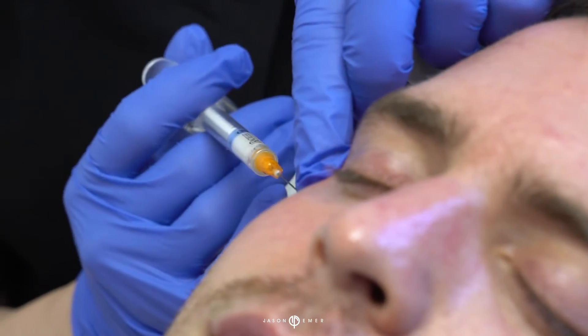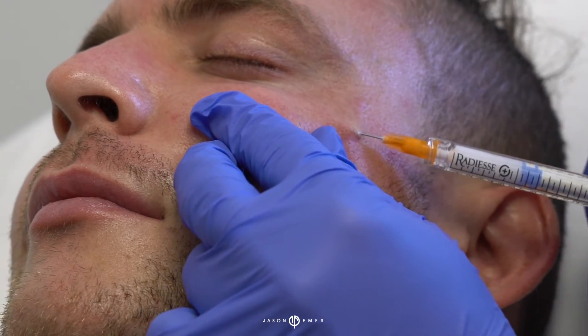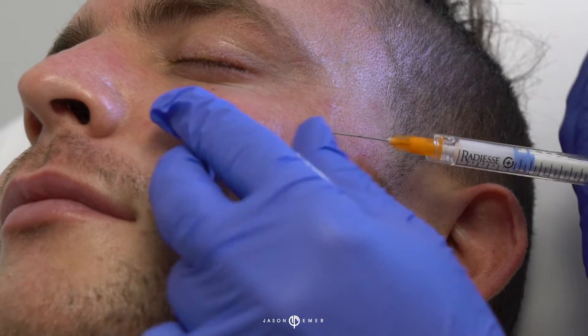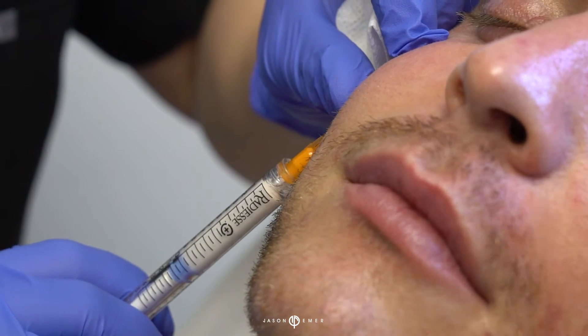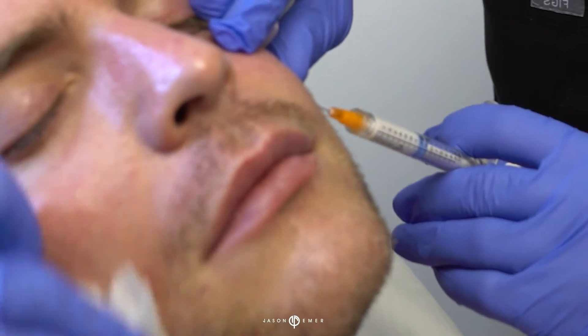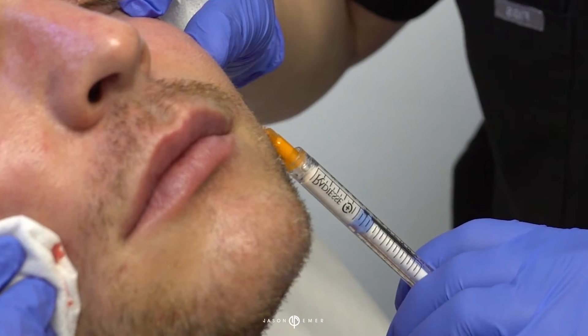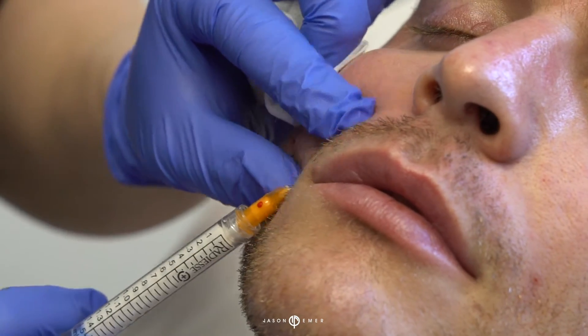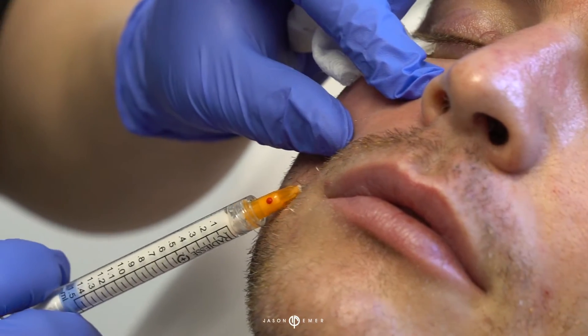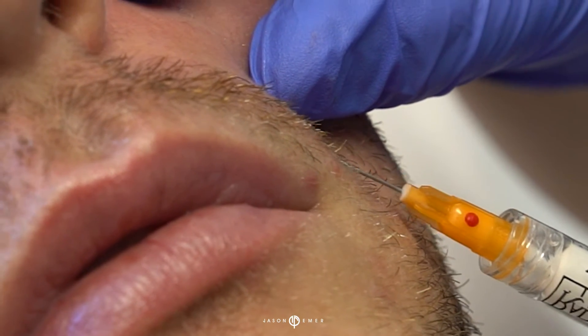We just did a little bit to the central cheek. Now we're going to do a little bit into a superior lateral position just to give him some enhancement, doing very little bits to support the deep medial fat pad — going right onto the bone to give some of that projection. Very small amount right at the edge of the nose, and again this supports the upper lip, the medial chin, and just the descent of the mid face.